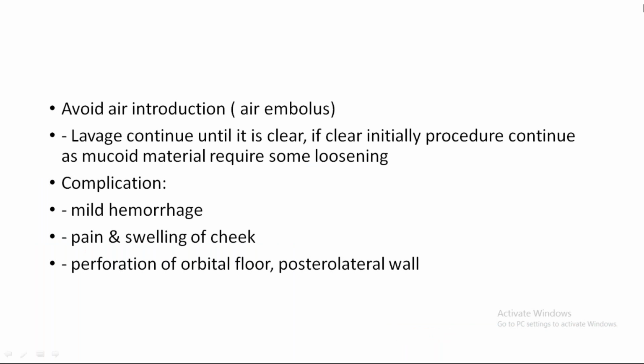Avoid air introduction in the beginning, but towards the end you can push 2-3 puffs of air so that the remaining few ml of fluid comes out.